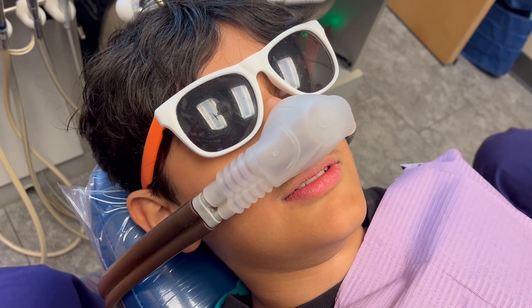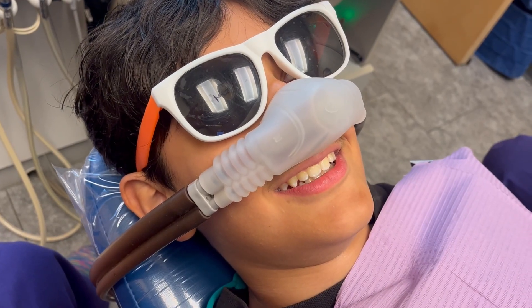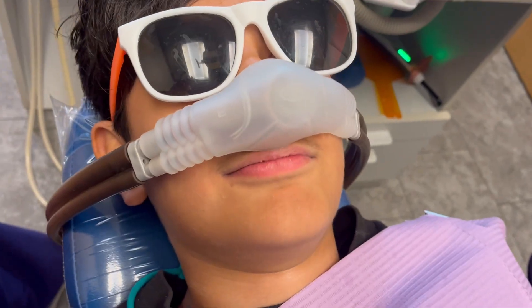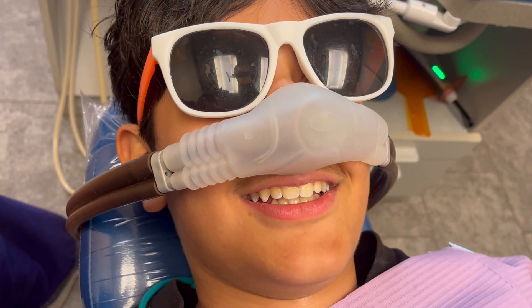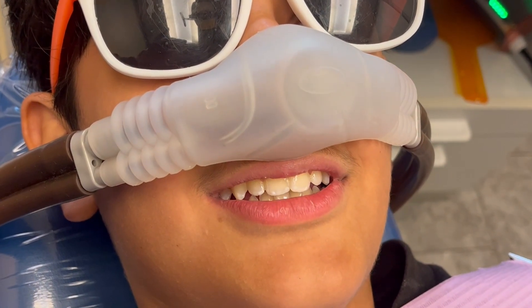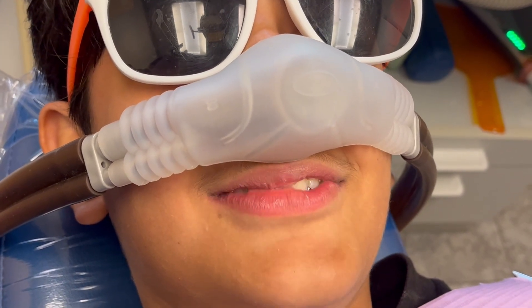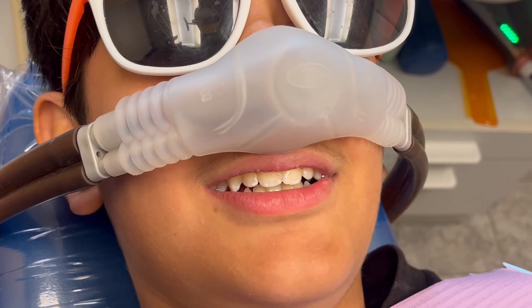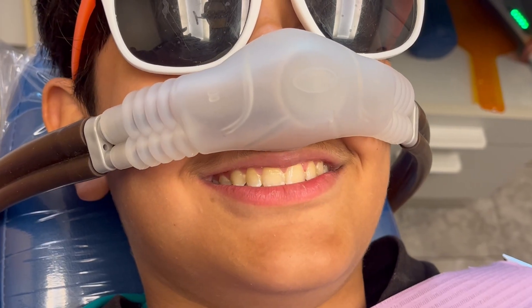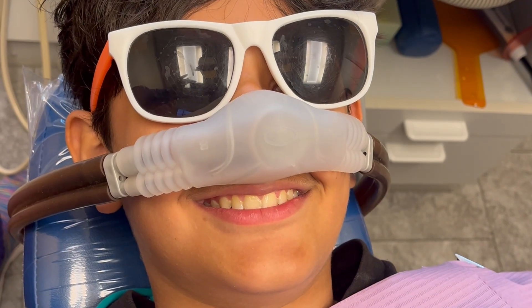How was that? Amazing! Did you feel getting numb — did you notice? Not really. How does your lip feel? Is it awake? Yes. Does your tongue feel normal? Yeah, my tongue feels normal. Can you tell your teeth are feeling numb? No, can't really tell. And did it hurt — when I was drilling the tooth, did you feel pain? No, I just didn't feel pain at all. Sweet! Smile really big — just to show you don't have a crooked numb smile. You look great! Awesome, thank you.